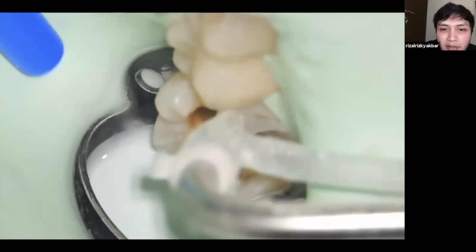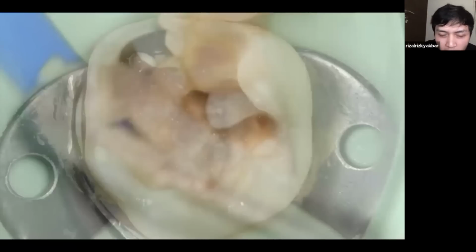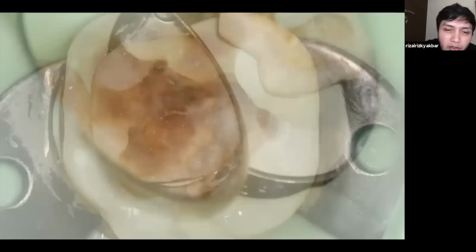So this is class 2 restoration with the buccal involvement. As you can see here, this is the beauty of using rubber dam. Actually, this is not rubber dam. Yeah, this is a balloon dam.